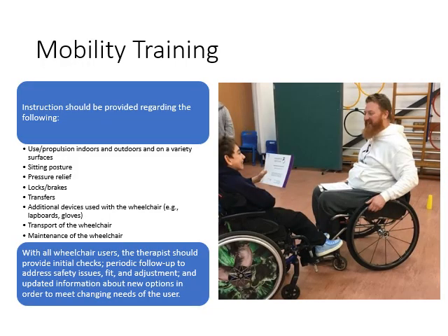Once our client has received their wheelchair, we need to provide instruction. So how are we going to use the wheelchair? Of course, we've already assessed their cognitive capacity to learn new skills. We've assessed their physical capability of using the device. And we've assessed the needs of the caregiver or the attendant. And we've determined what their goals are. Now we're going to provide instruction.